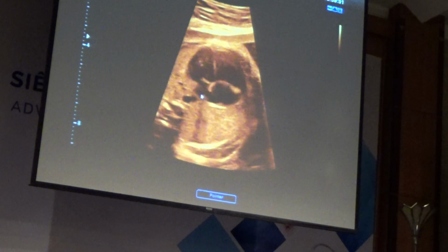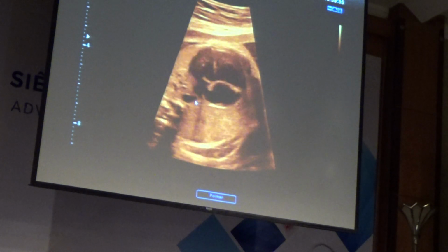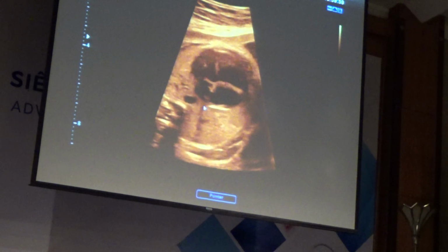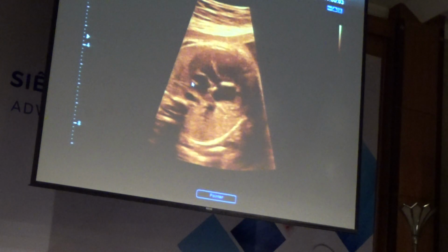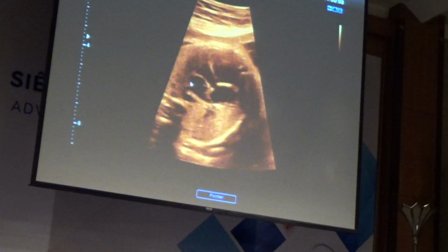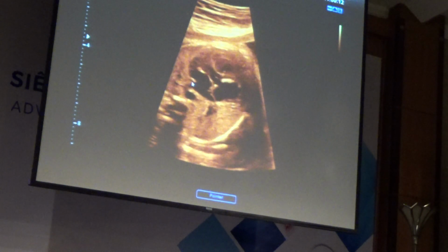You can see the foramen ovale valve a little bit here. You can start to see a pulmonary vein coming in here from the right. And here's this structure we'll talk about later between the left lower pulmonary vein and the left atrial appendage. So that's a good sign when we see it.